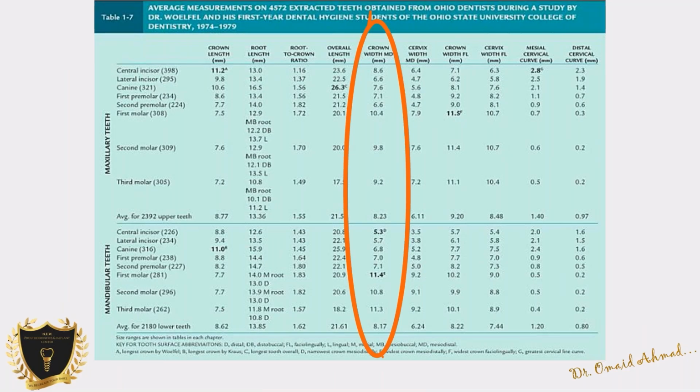If I send a case to an oral surgeon and say, okay, can you place an implant at number 19, just put it dead in the middle. But if I'm missing 18 and I'm trying to do 19, I will say, can you just look at the distal of number 20, and from the contact, go 5.5 millimeters and place the implant dead center over there, if I'm doing a freehand surgery.